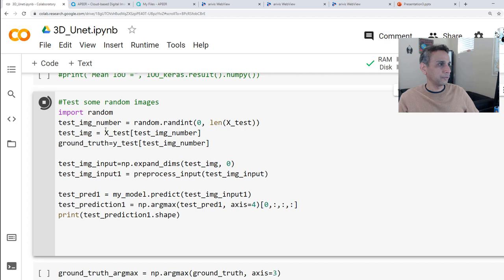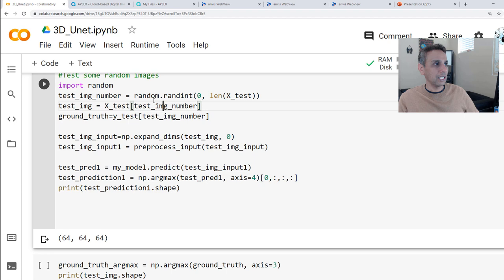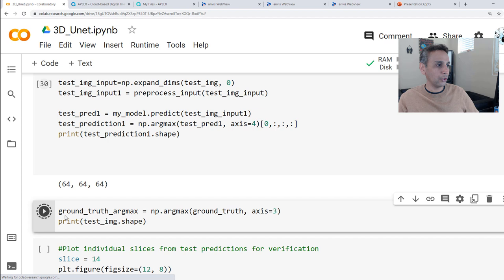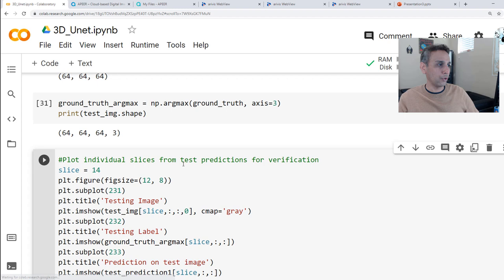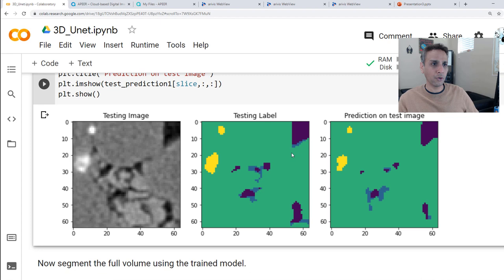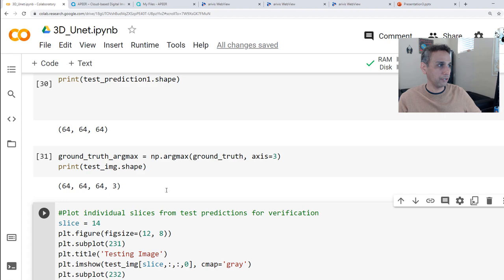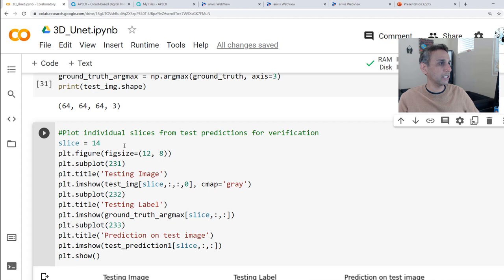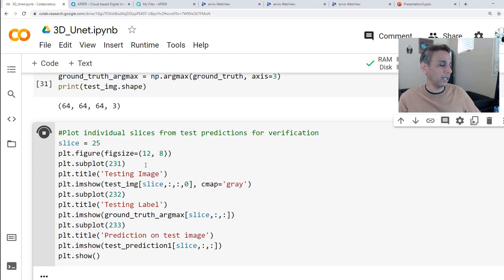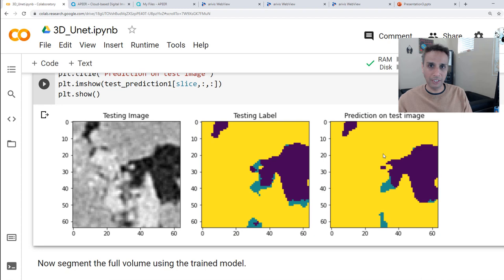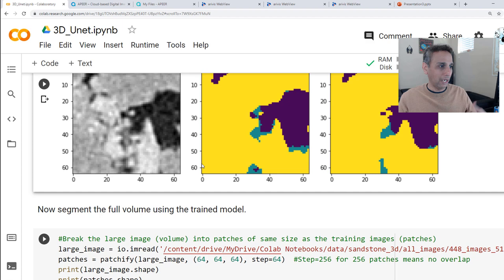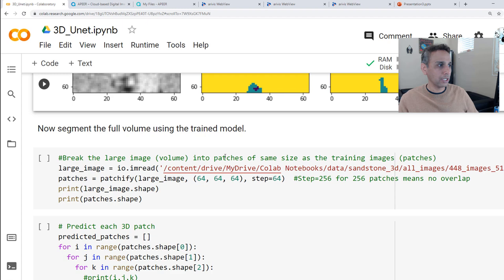Let's test on some random images. I select an image at random from the test dataset, predict it, then plot the ground truth versus the prediction on one slice. The prediction looks very nice and matches the ground truth well. We are predicting the entire test volume which is 64×64×64. You can change the slice number to verify across different slices.